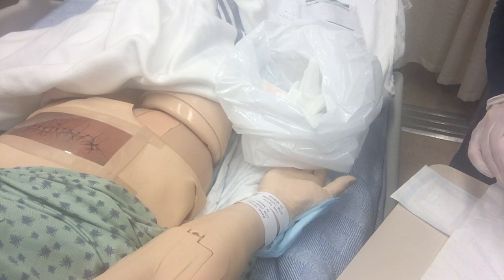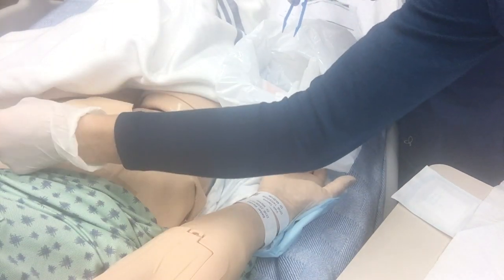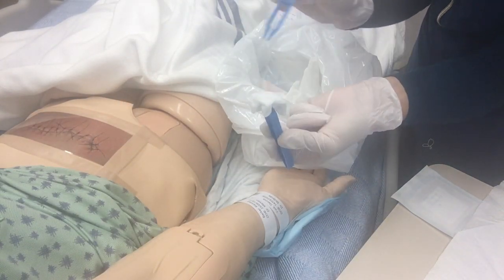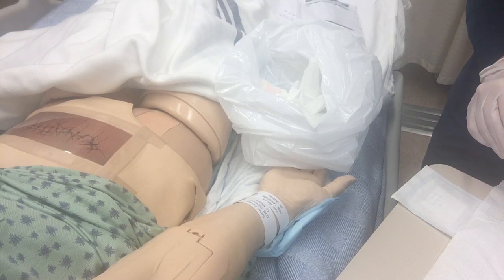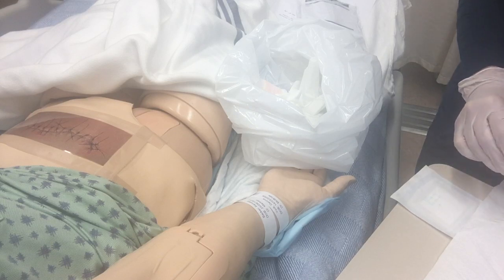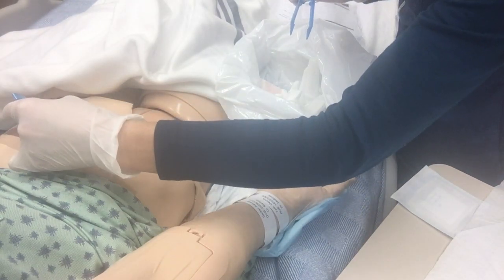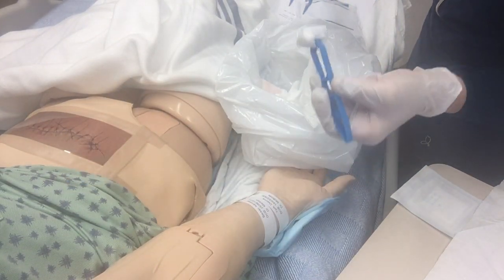I'm going to repeat that, making little bundles, putting them in my saline, and going again, one swipe per swab, noting, and once it's clean and I'm happy with how much I've cleaned it, I'm going to then dry. So again, taking the swab of gauze, clean gauze, folding it into a manageable bundle, and then this one's dry, and then just swiping or dabbing in the same direction, making sure that everything is clean and nothing else is coming off.